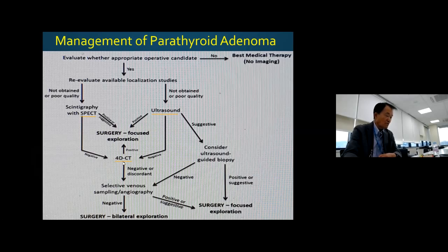We certainly had 4D CT, very thin section, high resolution CT, but ultrasound or CT shows some nodules in certain locations, but it cannot separate them from lymph nodes in a cancer patient. It's not easy. But in certain clinical conditions like hypercalcemia, where the parathyroid hormone is increased, then it's just a matter of location. So it's useful, but there's a high amount of radiation, and then interpretation, etc.